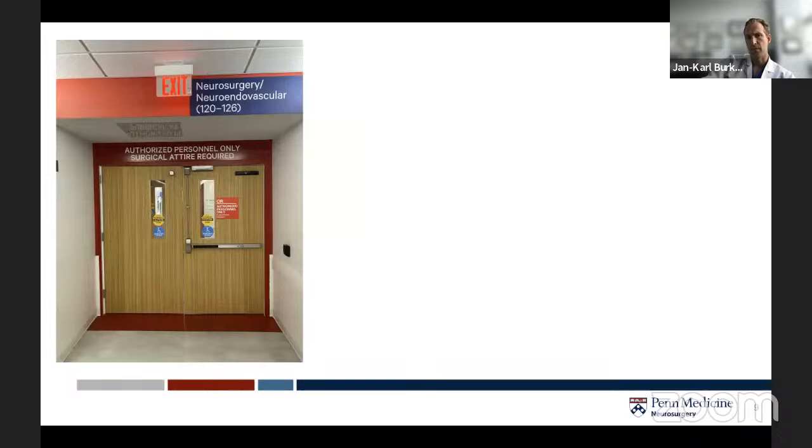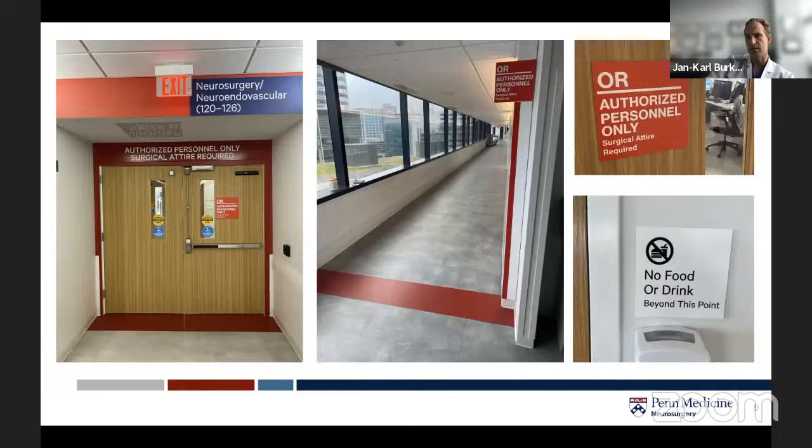That's the setup now, and since it's in the OR, there's a red line and you can't cross it with street clothes. For techs who worked for a long time in the IR space, it's a big change. Also for reps or other people coming in, you always have to change. You have to make sure you're compliant.